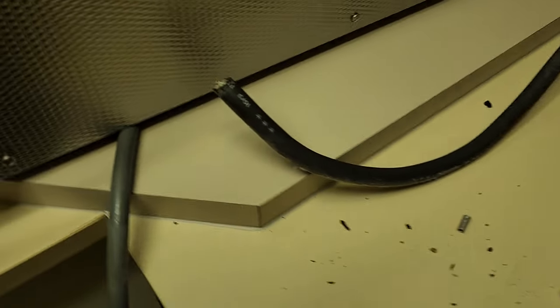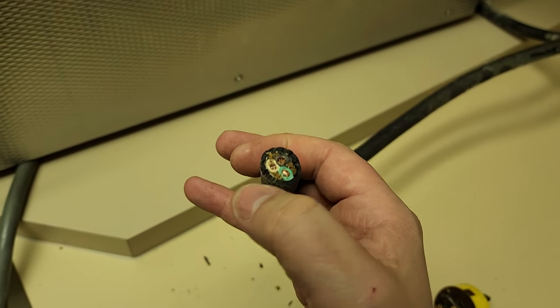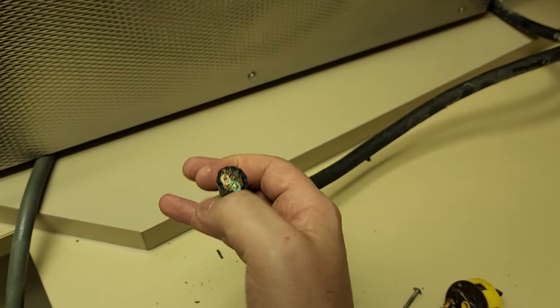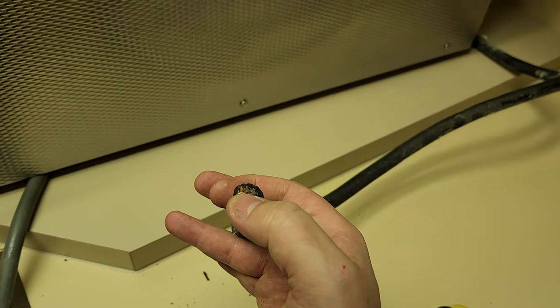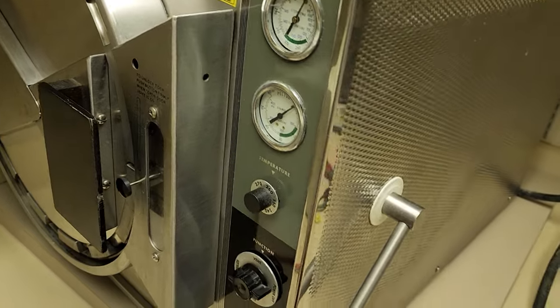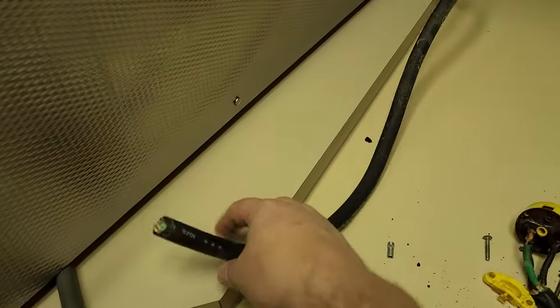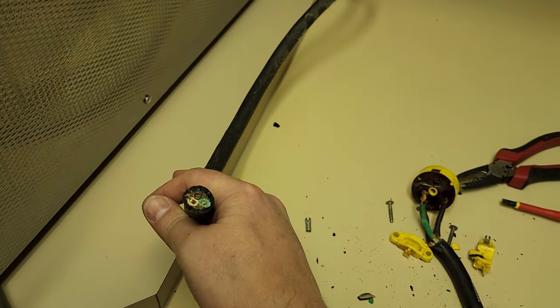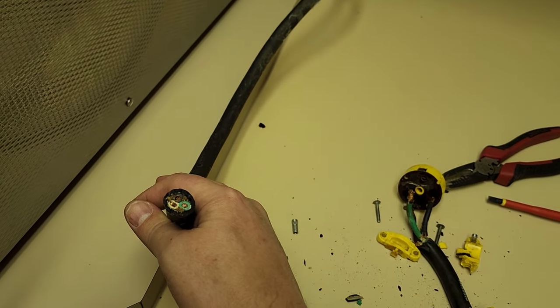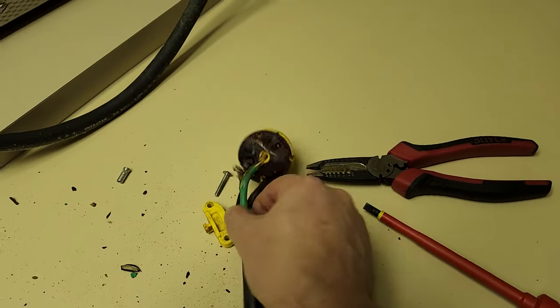So what I have to do is I'm going to ohm these guys out right here just to be sure, make sure that there's no dead short across them, which the heating element is still going to show probably 9 to 15 ohms on this guy. So, ideally it will not be a dead short, and there definitely shouldn't be any shorts to ground. So we're going to check that out. It appears like this guy was just pushed back and impacting things.